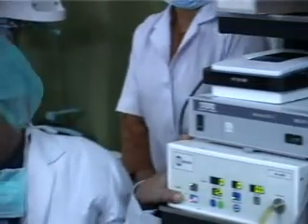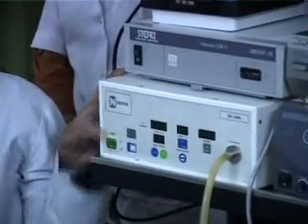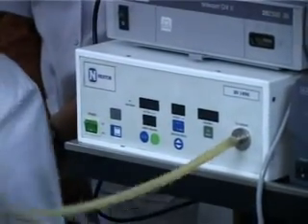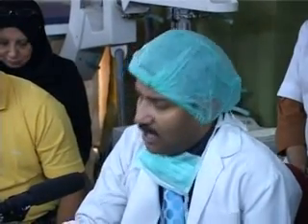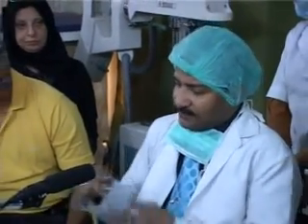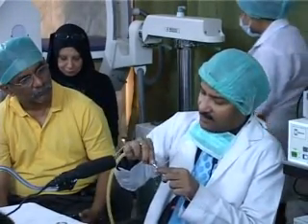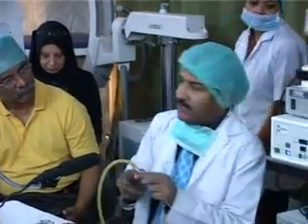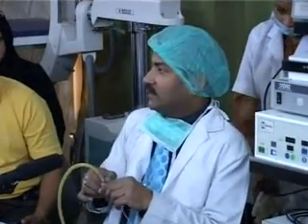These are the 4 settings. Now you will see here that when your insufflator is off, right now there is air inside. And this air is very dangerous, because if you connect the Veress needle, then connect the tubing and then switch on the insufflator, first this air will go into the vein, isn't it?